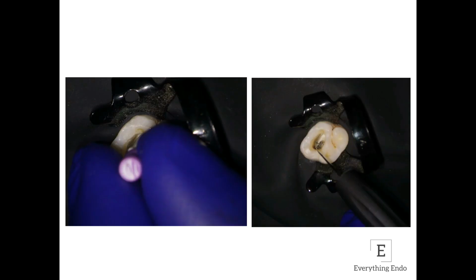The advantage is that these handles are at an angle. When you use a conventional hand file and try to negotiate or locate a canal, your gloved finger comes right over the tooth and you cannot really see the tooth at all, or the point of negotiation. But when you use a K file that is attached to a handle which is offset, you get complete visibility.